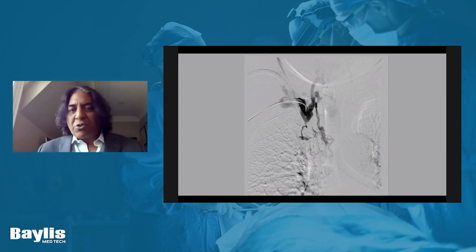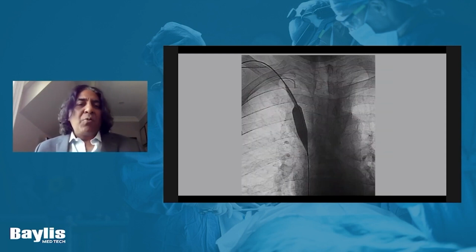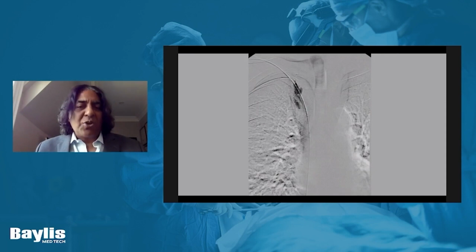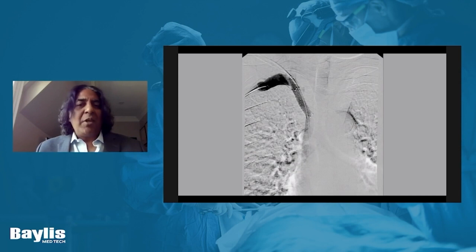I'm just going to highlight a personal case we had where this person was occluded centrally. This was actually pretty easy to reverse. We just took out the catheter, but we balloon dilated this, and the balloon opened up. And when we injected contrast, there was staining in the mediastinum, but we also saw contrast staining within the pericardial space. So a real concern. The patient started acting a bit wiggy, let's say, and we quickly dropped in a 10 millimeter Fluency stent graft in this case to deal with that lesion. And again, with this run, you can see no extravasation.